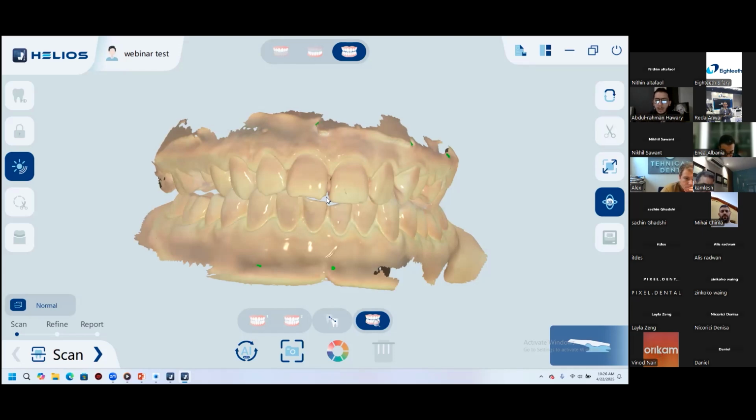With the previous version, with the scan, you used to have like 16 and 17 microns. Now the probability of reaching higher microns is less. There will be no huge deviation between the right side and the left side. The whole scan will be more stable, so the whole scan will be on 13 microns or 14 microns. There will not be an area of 16, for example, and another area of 12. You get the idea? But the maximum amount of deviation is still the same. So the worst is 20 microns, but the probability of reaching 20 microns is less.